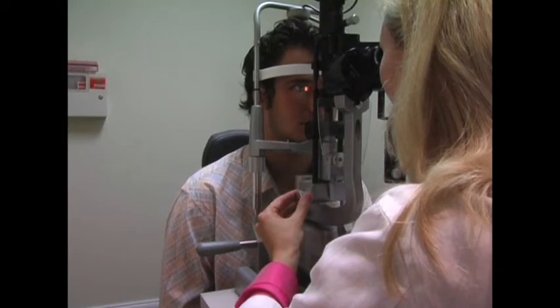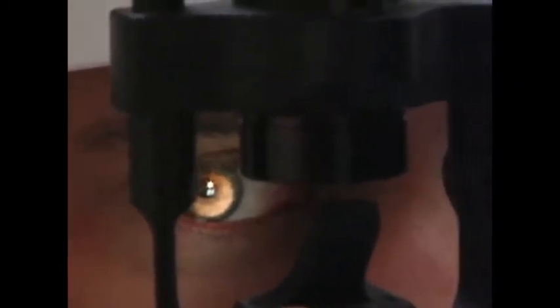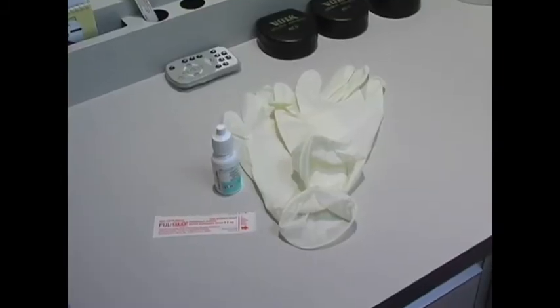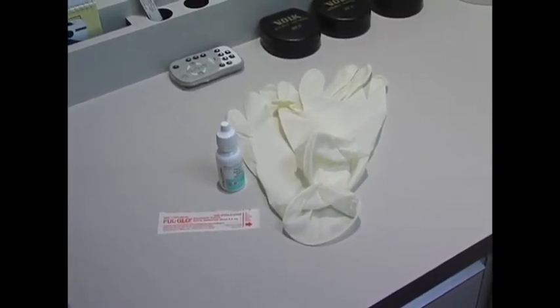Start by examining the eyelids and lashes using a tall, broad beam of light under low magnification with the light arm and microscope arm in midline position. Next, using the same settings, evaluate the surface of the conjunctiva, cornea, and sclera. Remember, small adjustments in focus and lateral movement are made by moving or rotating the joystick. In patients with traumatic eye injuries, be sure to examine the entire sclera, conjunctiva, eyelid margins, and canalicular system for signs of lacerations. If a corneal abrasion or herpetic lesion is suspected, you should perform a fluorescein examination using the cobalt blue filter.